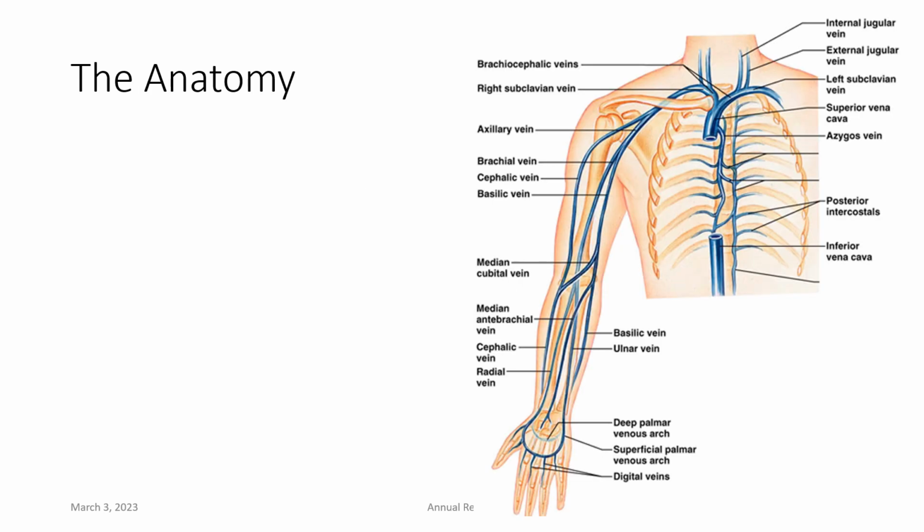Really quick to begin the process, let's start with our anatomy review. So if you see here, we have a nice patient. You can see this is their superior vena cava. Now, when we're thinking about the venous system, we have to remember that the blood is all going towards the heart. So it's one approach where you can learn the major veins outward, or you can look at it as the blood drains. So let's start by that matter.